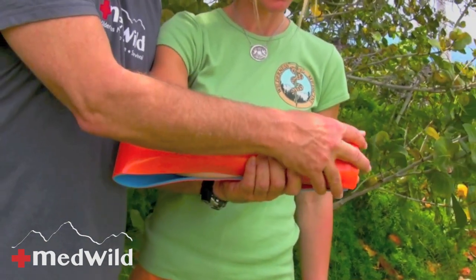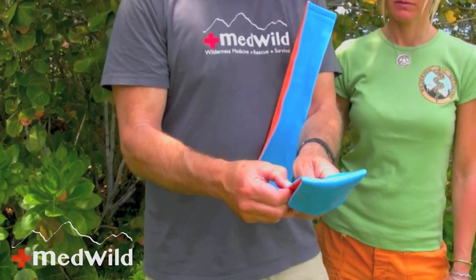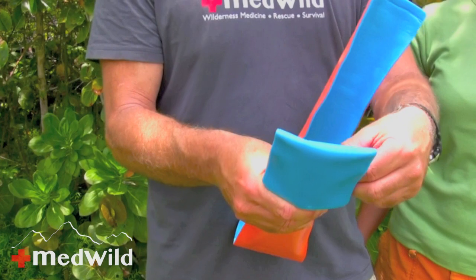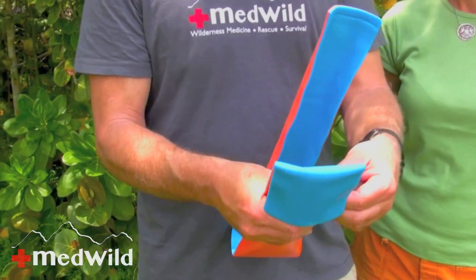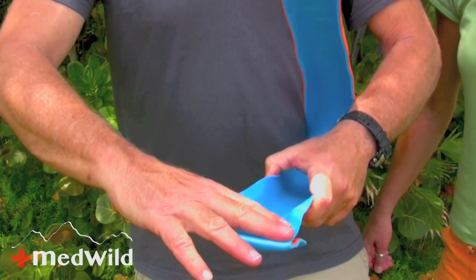There is one trick I use to make this a little stronger over the wrist. I'll often put a small reverse C bend in right here — a reverse is simply what it sounds like: you take the C and put a small reverse in the opposite direction right over the area of the wrist. What that does is make it stronger over the wrist where you're worried about too much flexion, making this portion super rigid.